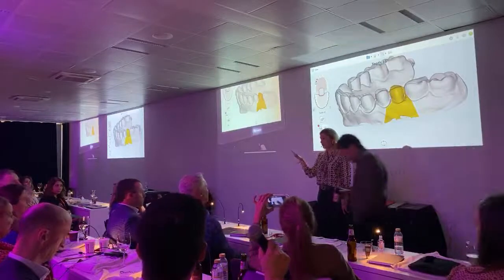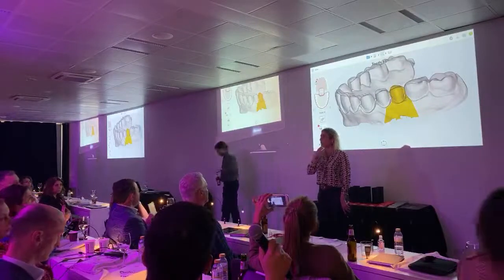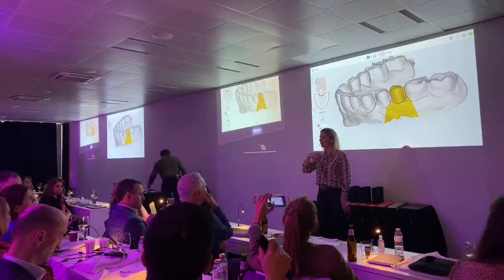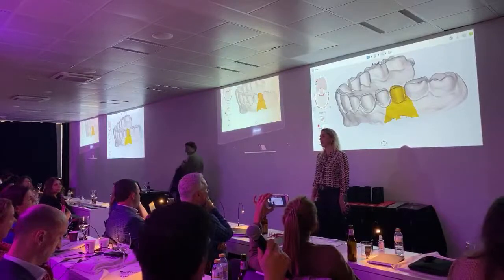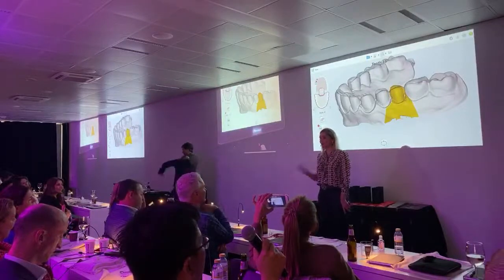Already prepped. And the cords. I do the scanning of the arch. And then I remove one cord, I scan the prep. I remove one cord, I scan the prep. That's why, if some bleeding happens, I can easily control it.